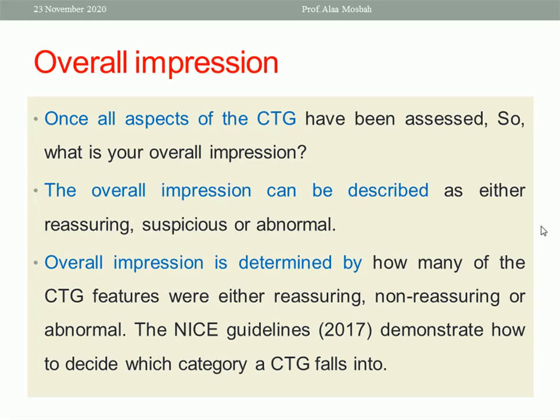After all of this, you should put your patient into a certain category or describe the CTG as reassuring, suspicious, or abnormal.